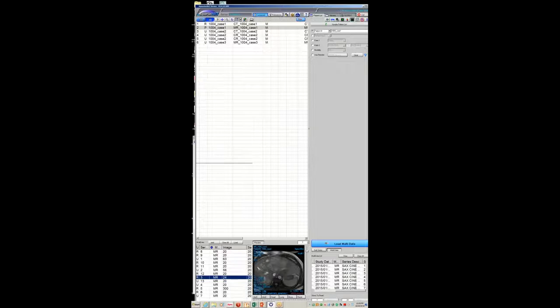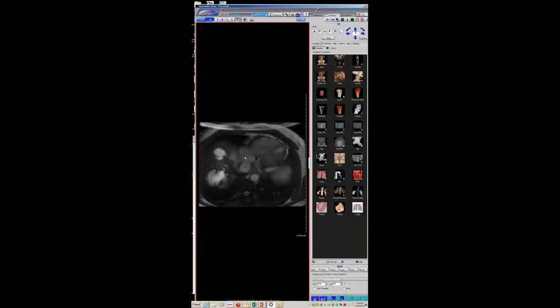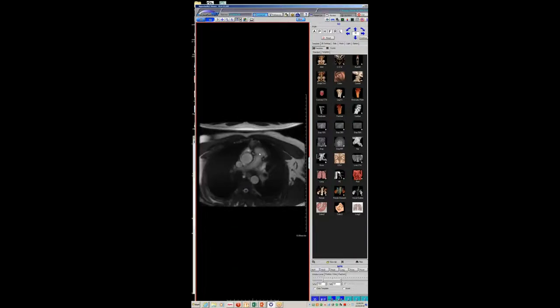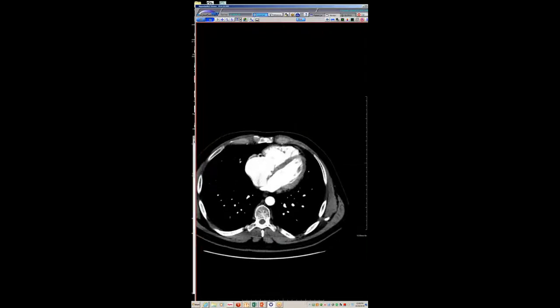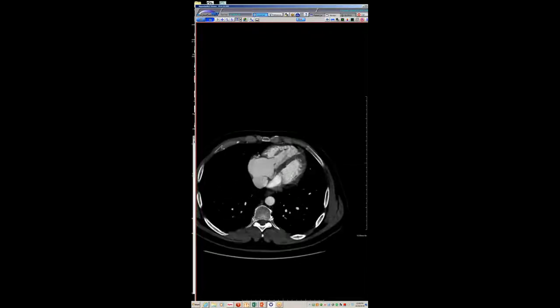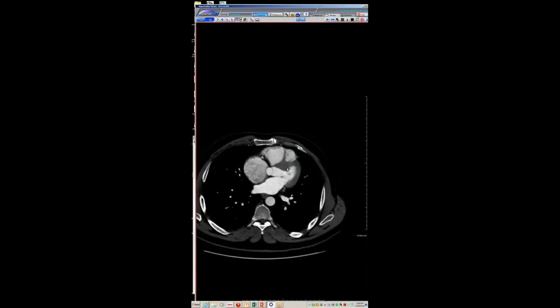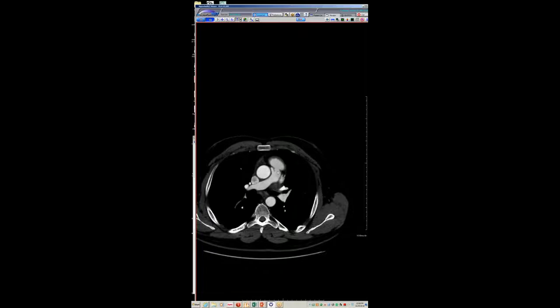On a short axis image, you can see the valve leaflets are thickened and there's a very reduced opening area. This patient has a history of malignancy, and if you look, you may be able to see some areas of masses within the liver. Here you can better see all the different masses in the liver, even on this axial localizer. You can see the thickening of the pulmonic valve and tricuspid valve.